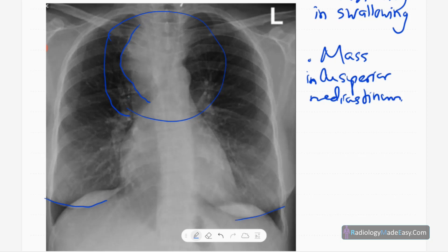The upper border of the mass extends above the medial margin of the clavicle. This means it appears to arise from the neck region — this is known as the cervicothoracic sign.